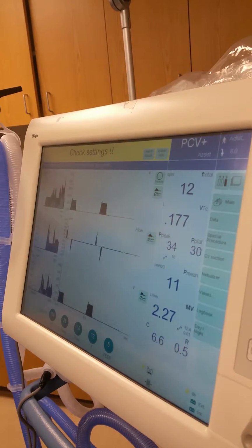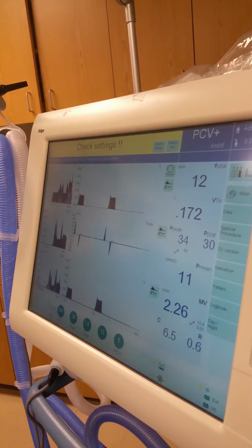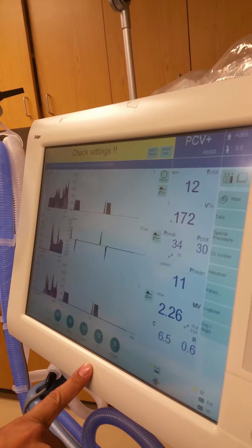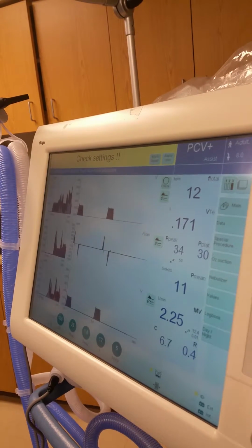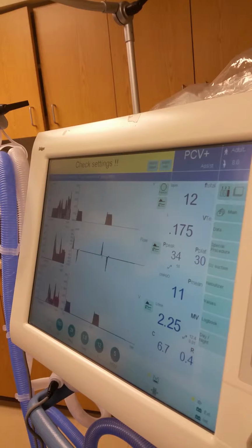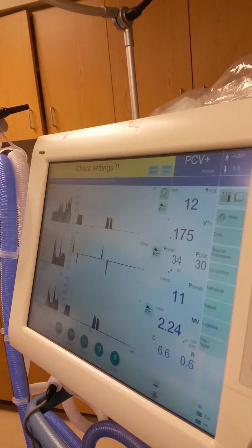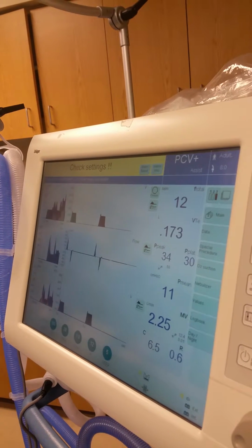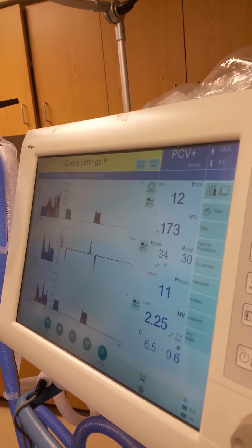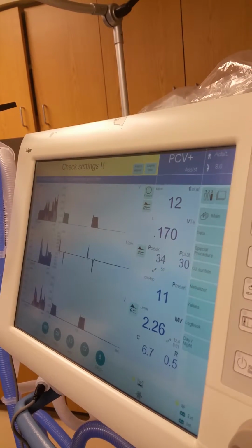scarring to your lungs. I wasn't trying to put you on the spot, but once you get an adequate volume, you want to do rates. You want to increase rate to blow off CO2. Once you get an adequate volume, unless you're in those scenarios where you might be maxing out both, because I might have a rate of 30 and I still can't get my CO2 to blow off, so I'm going to get bigger volumes to help blow it off. And it's just the scenario you're with, and that's going to come in time.